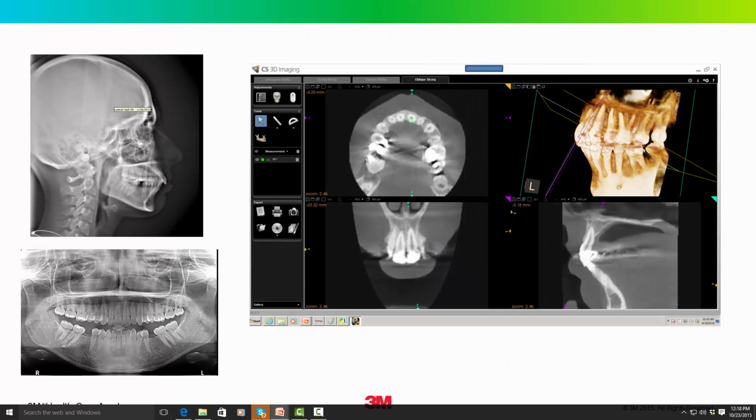This is an adult patient. We treated her by extracting 2 upper bicuspids, and we were closing the lower space from the missing second bicuspids. You can see that as we retract those upper incisors, we're starting to get dehiscence along the lingual leading edge of the tooth. You can dehisce through the lingual cortical plate just as easily as the facial cortical plate, although as orthodontists, it's nothing that we could see on a cephalometric x-ray, and I'm not sure we're really, up till recently, cognizant of perforating through the lingual cortical plate.